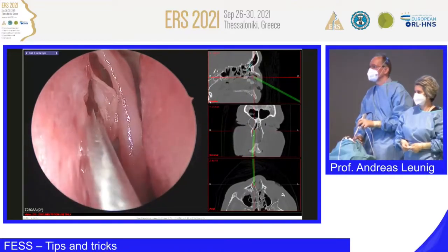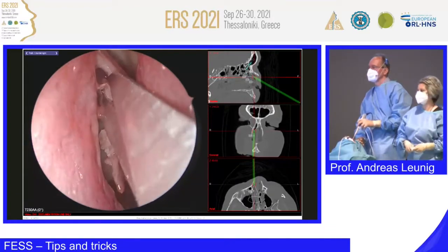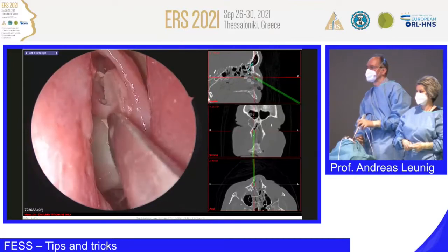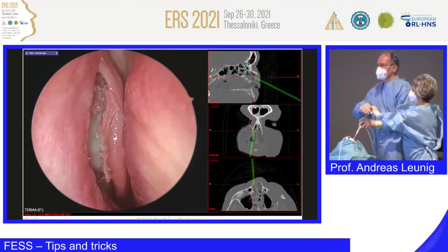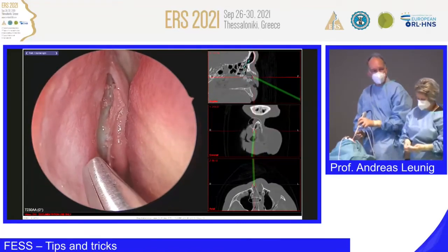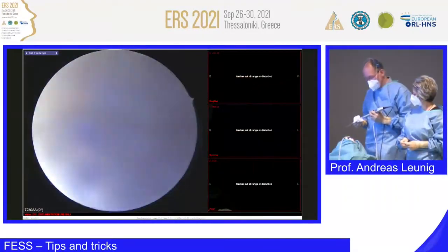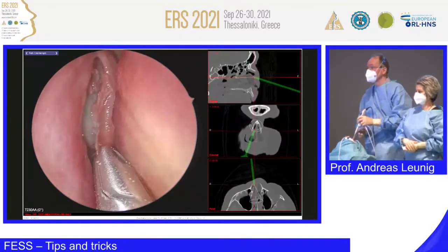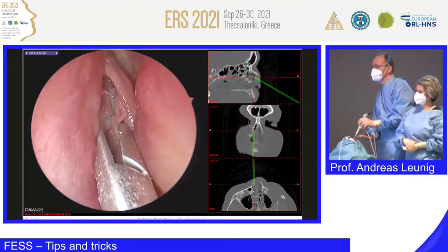Now, I bring it a little bit more medially. And this is the so-called Messerklinger or Zurich scissor. And I cut the uncinate process superiorly. Oops, like this. There's still a little bit of attachment here, and I can promise you, as long as you use your cotton swabs and your atraumatic technique and you are nice to your anesthetist and you have a normal blood pressure, sometimes mild hypotension, it depends on the case, then you will see your structures. You can do precise sinus surgery according to Messerklinger and Stammberger. And for me, it's the most convincing technique, I can tell you. I do it now for 30 years or even more.